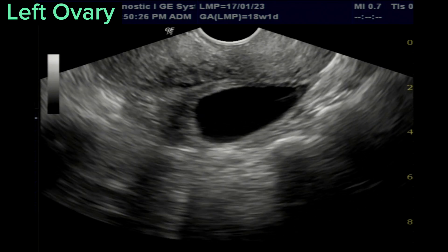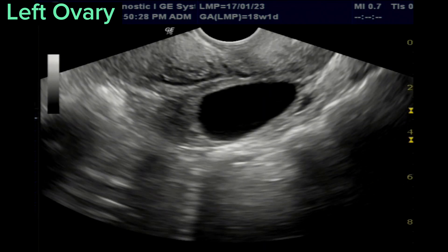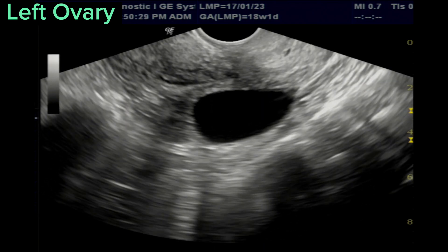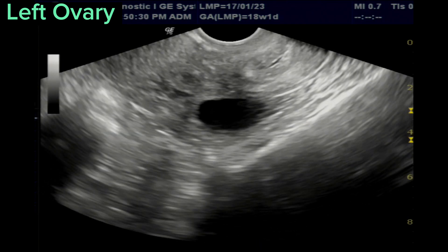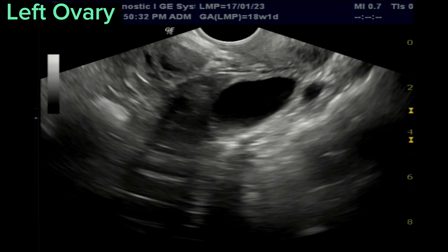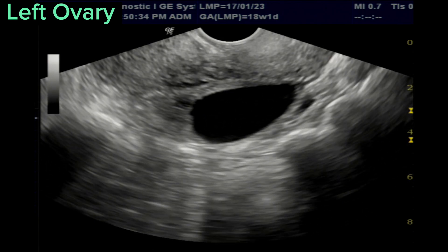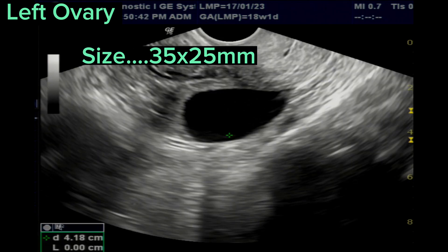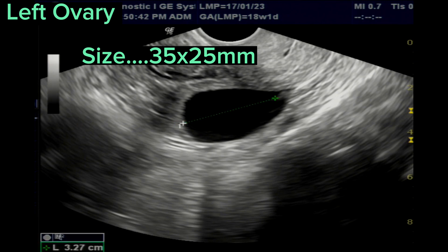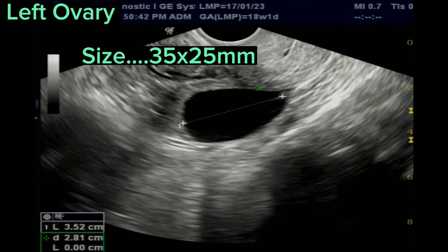A TVS scan is done. We can see a left ovarian follicular cyst. This is thin-walled, filled with clear fluid, no internal septa, no debris, size 35 x 25 mm.